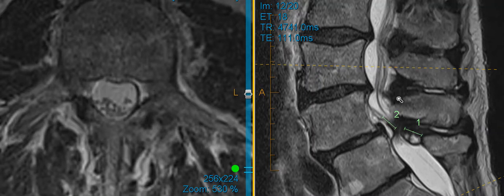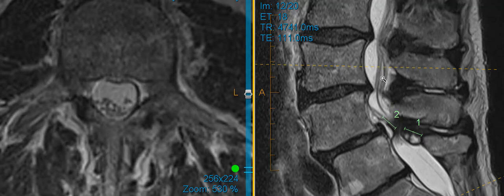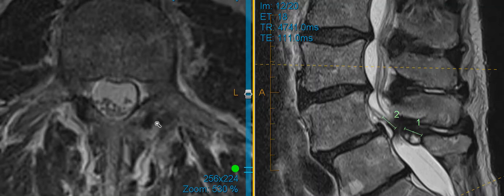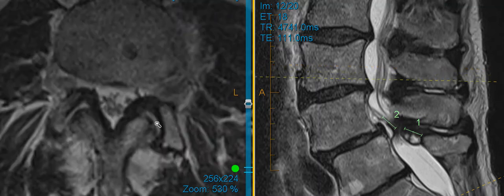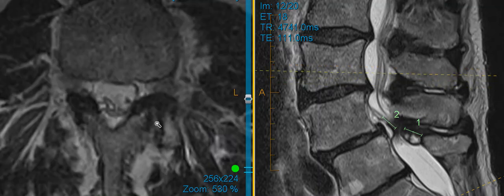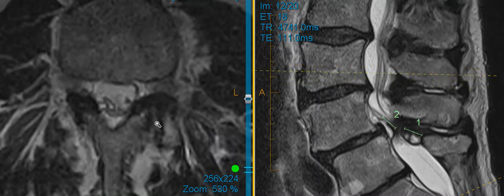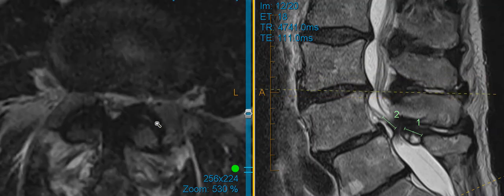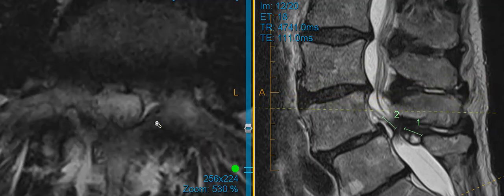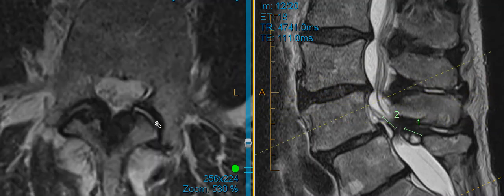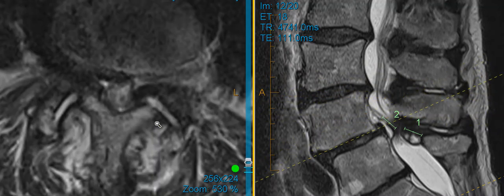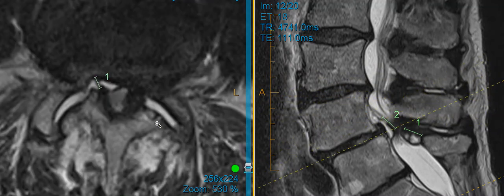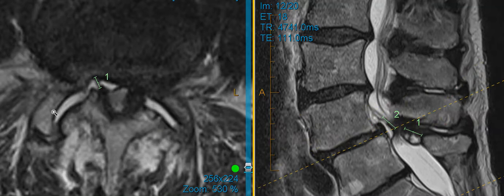These little dots correlate to these lines over here on the right. Those are free-floating nerve roots in a pool of water or spinal fluid. Everything's fine there, but it really helps understand what's normal and what's not. So there's some narrowing right here at this disc and again down here at the 4-5 segment, we've got all this stuff going on, really pathologic degenerated discs.